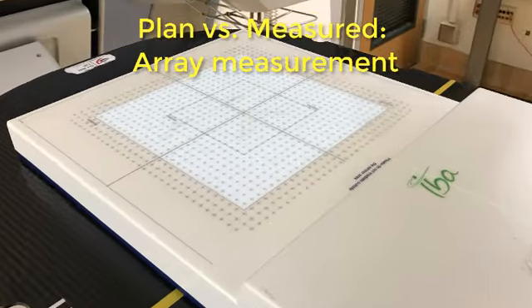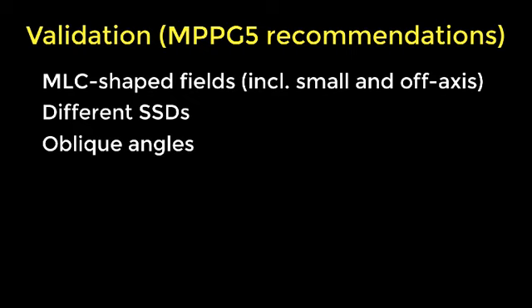And I'm not going to give you every single test that the report recommends, but I'm going to hit the highlights. So first, it recommends that you should look at MLC-shaped fields, and that should include both small fields and fields off axis. So again, measured versus treatment planning system predictions. You should do measurements under different SSDs. You should measure beams that come in at oblique angles, not just straight down on a phantom. You should measure test fields with wedges, make sure those are correct.